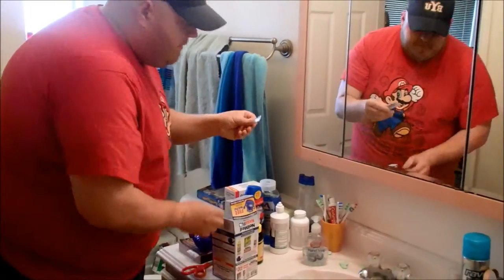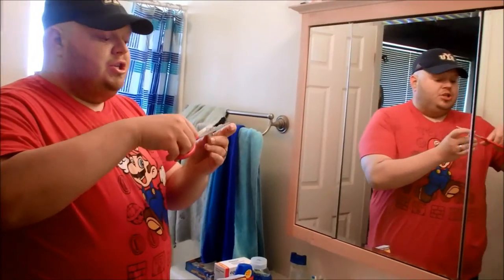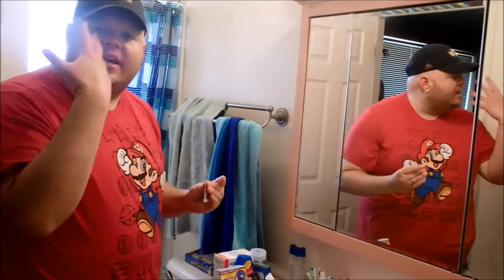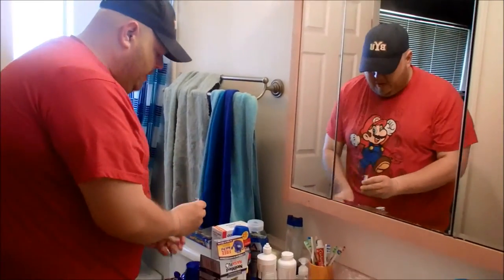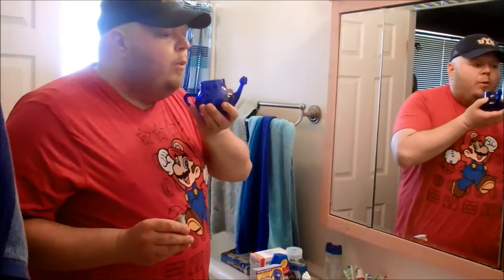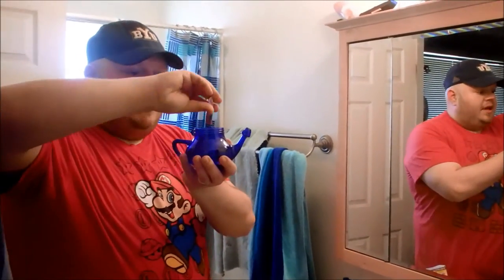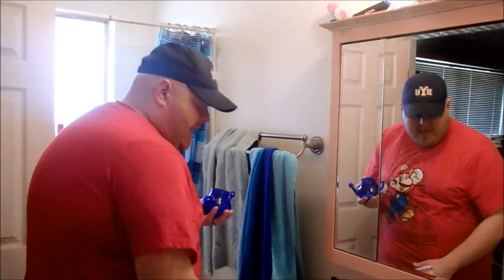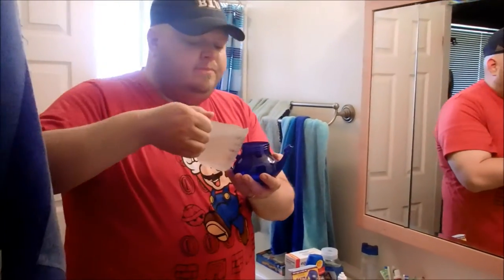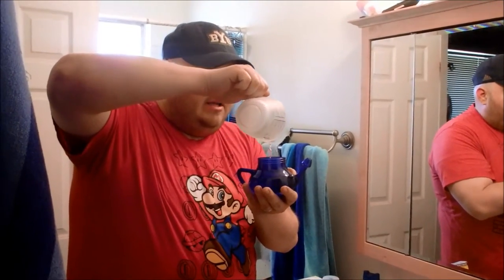Then take one of these salt packets. This is clinically matched to your body's own salinity level, so it won't sting or burn as it goes in. Take that and make sure all the genies are out of the lamp. Pour this in, then take your warm — but not boiling — boiled, purified, clear water. Eight ounces.